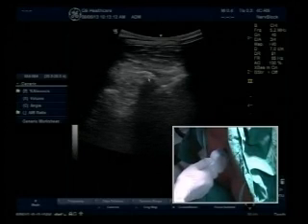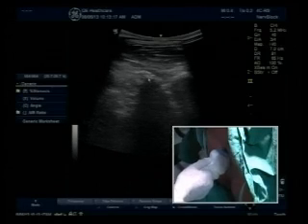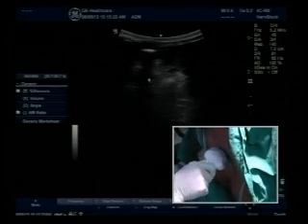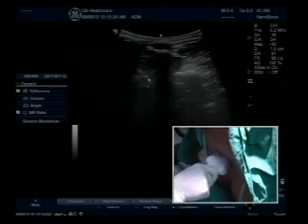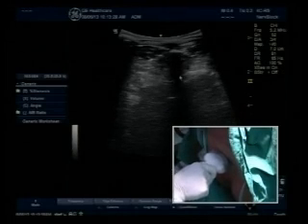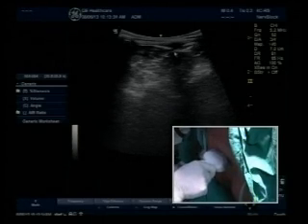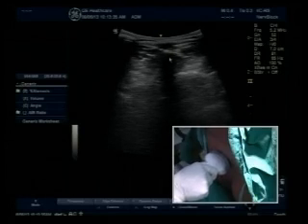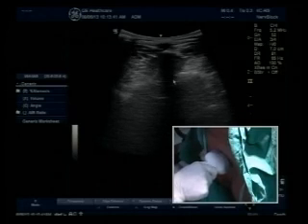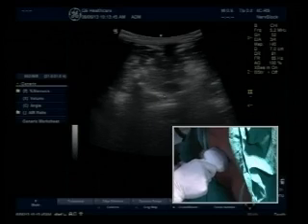Now I'm going to rotate the probe transversely. You can see on the screen there, I'm moving it transversely. See how the picture changes there. Can you see? It's basically complete shadowing, complete black shadowing, because I'm pointing it towards the tip of the lumbar spinous process. So there's no acoustic medium going through. It's a bone.